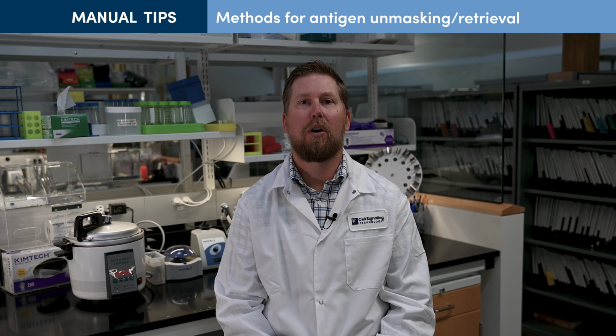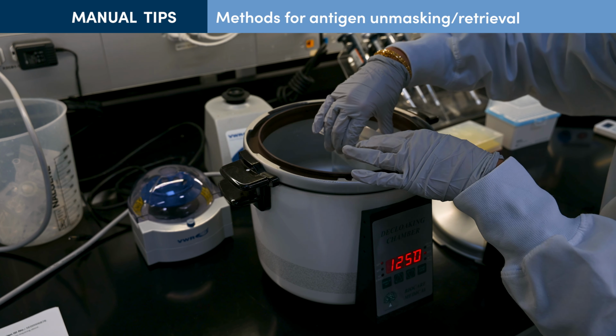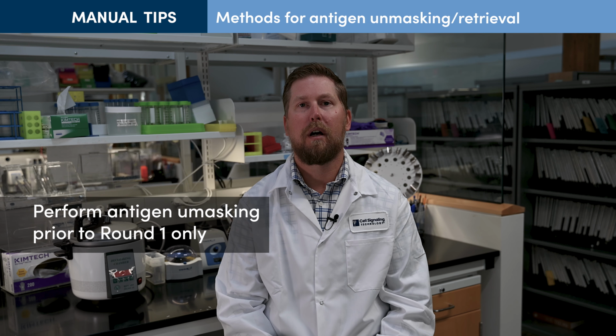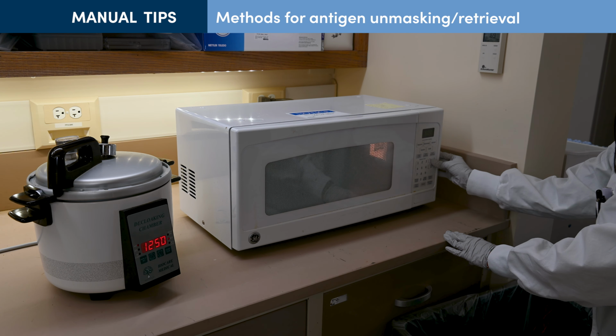Antigen unmasking, also known as antigen retrieval, is performed prior to staining to make epitopes more accessible to antibodies. The SignalStar manual protocol includes antigen retrieval steps using either a pressure cooker or a microwave. Note that antigen unmasking is performed once, prior to round 1. Unmasking is not required for round 2. To optimize your microwave settings to maintain a sub-boiling temperature, refer to our Tech Tips video on this technique, how to perform antigen retrieval in IHC, by clicking the link in the corner of your screen.